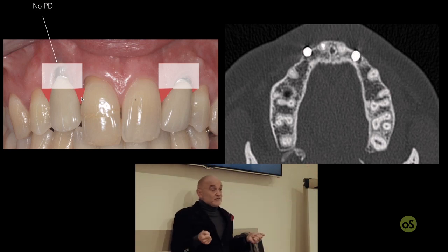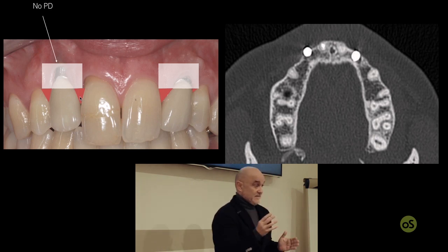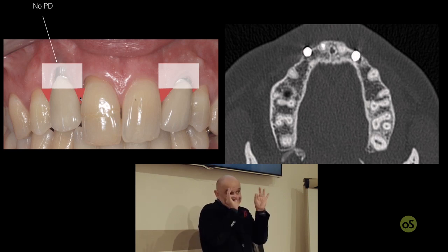And so compared to the surface that you want to cover, you have very, very palatally displaced papilla that gives you very, very weak blood supply. And they are so triangular, so thin, so narrow, so squeezed, that if you desepithelize them, how much blood supply can this papilla give to the surgical papilla of the flap?